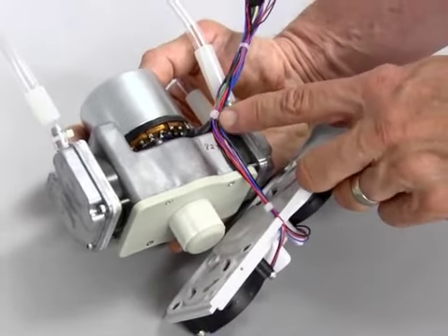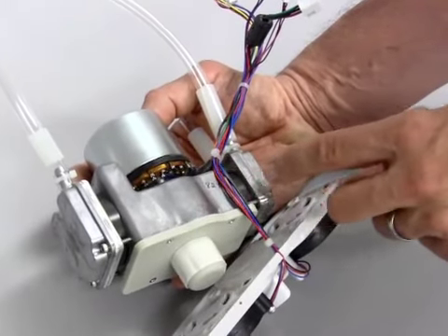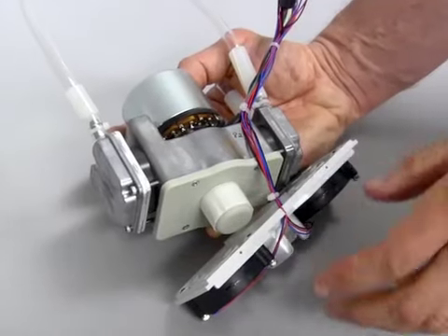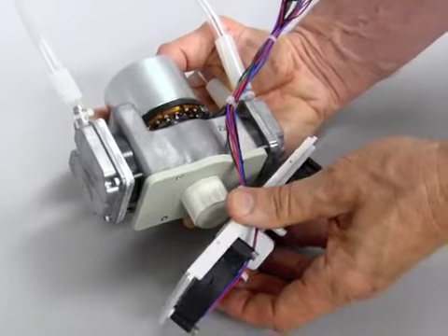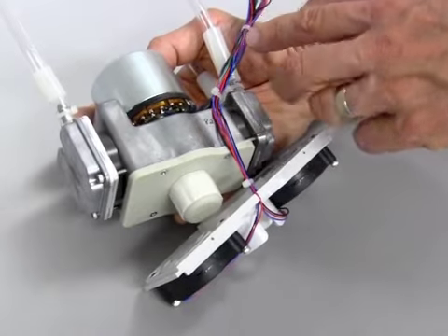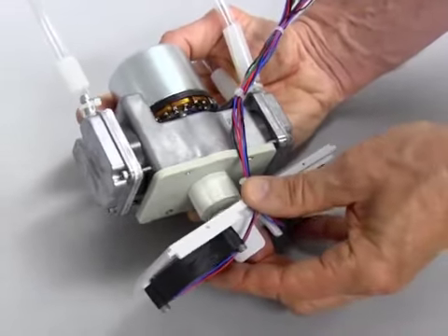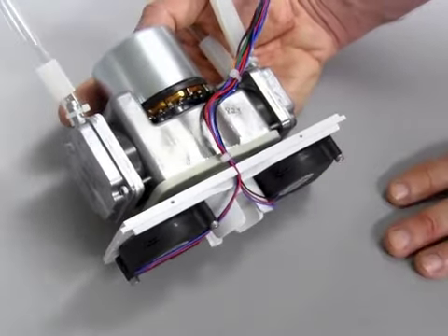And then you would have to cut the two wire ties on this wire bundle to remove the fan power lines. To put the new fans in place, all we would do is get the fan assembly, right? You would, and I'm not showing this, but you would put the cables back onto the bundle, wire tie them in place, and then you would push the fan assembly back onto the bottom of the compressor like that.